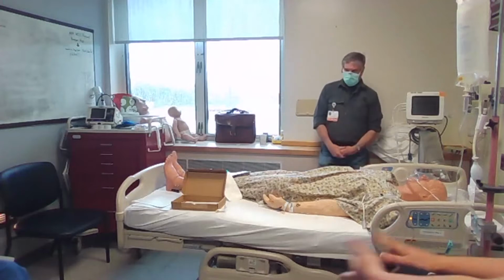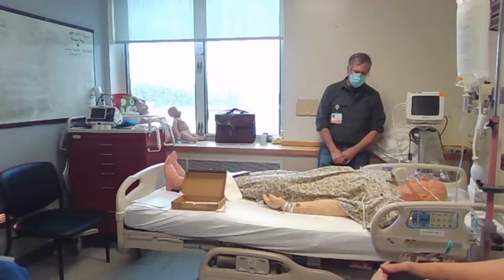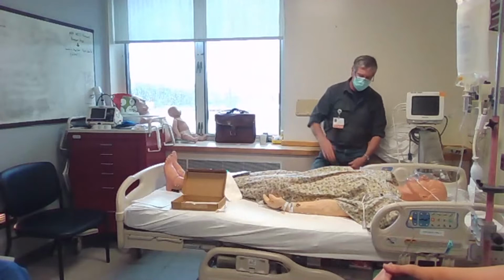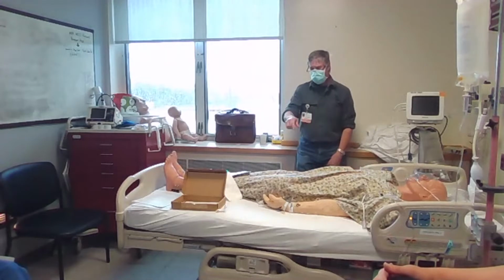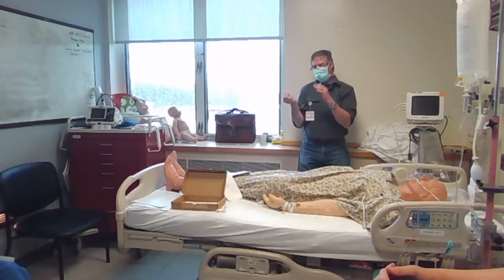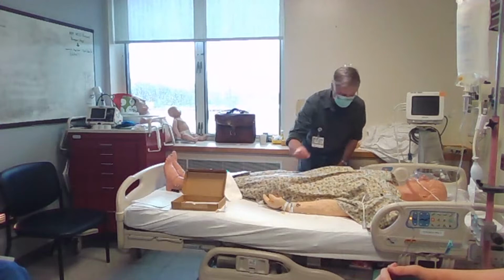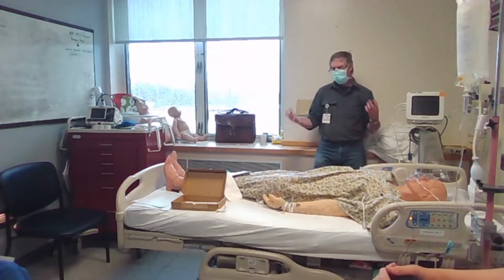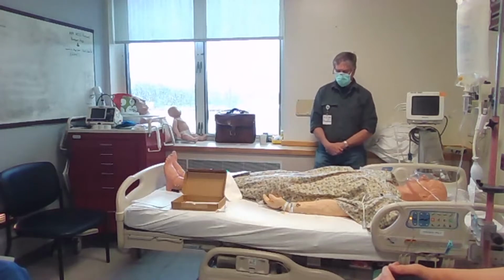Most commonly used is the radial. There's also the dorsalis pedis, which is an artery down in your foot, and the femoral. They actually have femoral line kits with a longer catheter. So this would obviously be used for something shorter: radial, ulnar, maybe the brachial. But once you get to the brachial, you're looking for a longer catheter because it's deeper to get down to the artery. And femoral is your last one of choice typically because it's so infection prone and you don't want to induce bacteria into the vascular system.